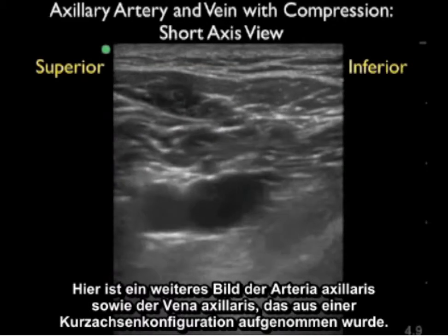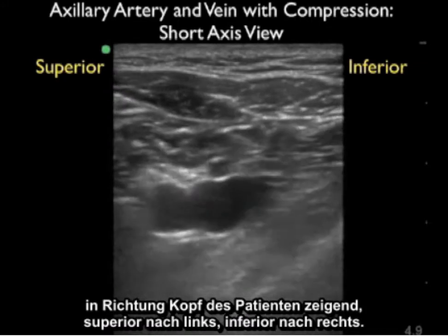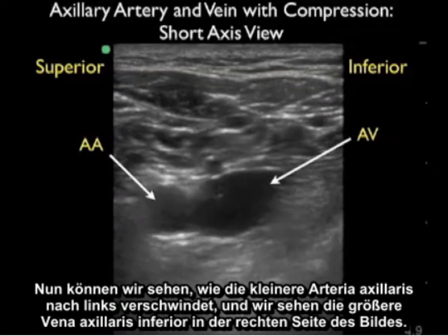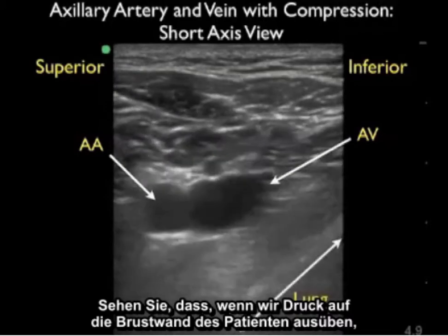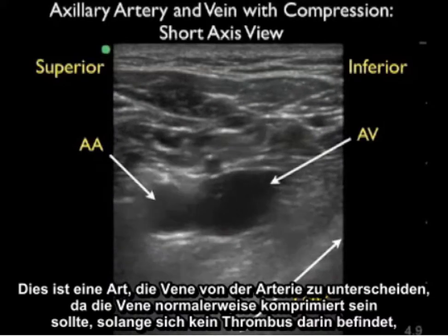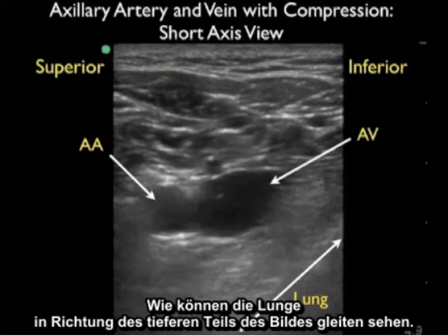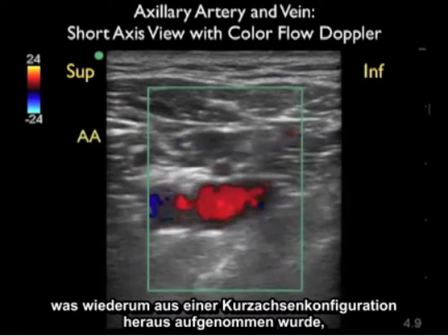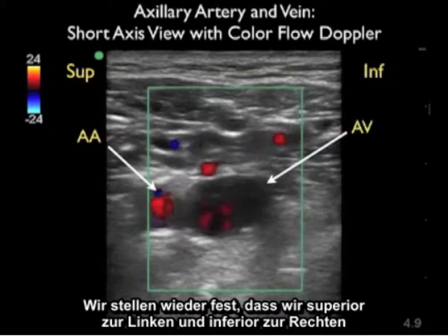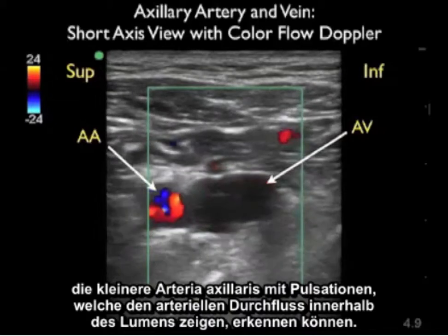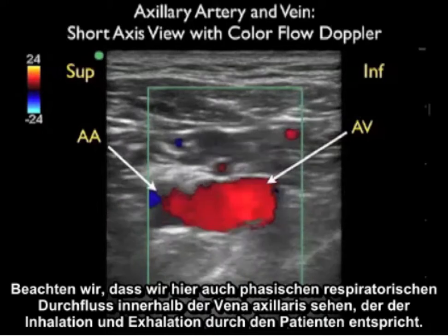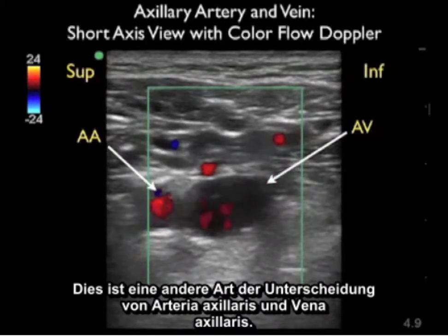Here's another short axis image with superior to the left and inferior to the right. The smaller axillary artery is seen superior and the larger axillary vein inferior. As probe pressure is applied to the chest wall, the axillary vein compresses — this differentiates vein from artery, as the vein compresses when no thrombus is present while the artery stays open. Lung sliding is visible in the deeper aspect of the image. Using Color Flow Doppler, we can further differentiate the vessels: the axillary artery shows constant arterial pulsations, while the axillary vein shows phasic respiratory variation of flow corresponding to inhalation and exhalation.